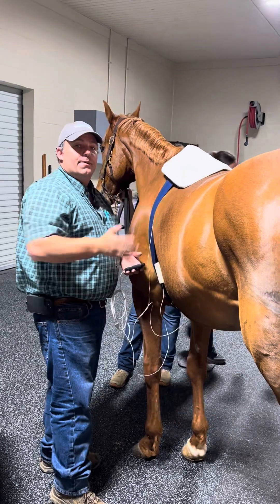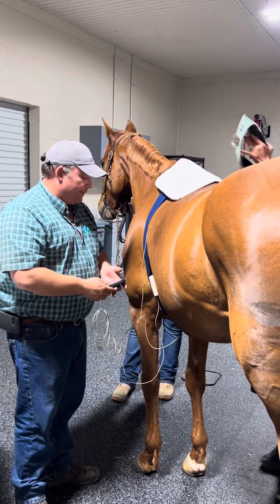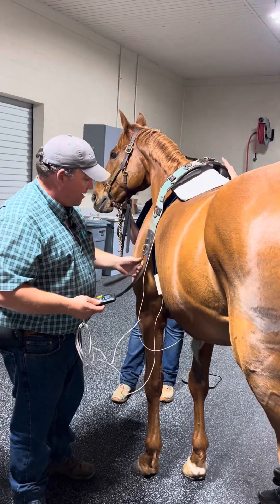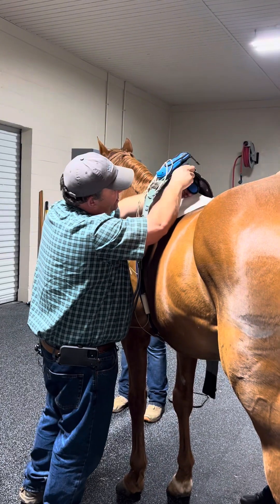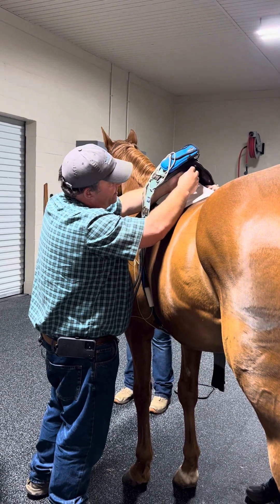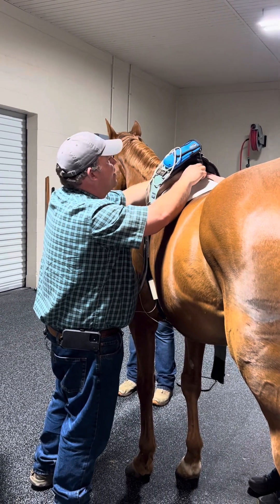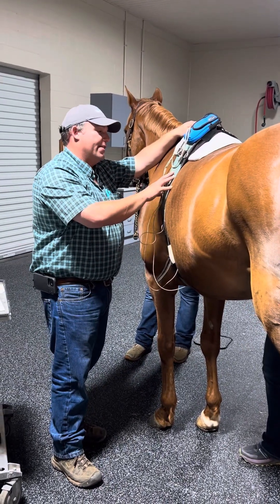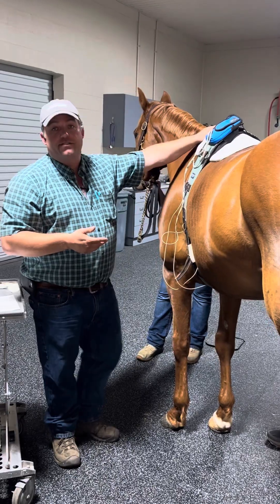We will use a SIR surcingle to help hold this in place, so that way he can lay down, he doesn't have to stay tied, doesn't have to stay standing. We're just attaching the ECG to the SIR surcingle. We like to keep it on top of the horse so there's less likelihood of actually damaging the machine. The main point of the SIR surcingle is to help keep the electrodes attached to the horse so he's free to move around a stall.